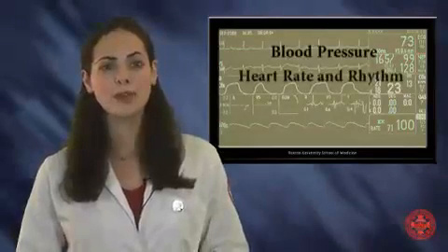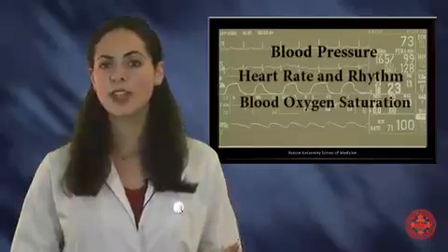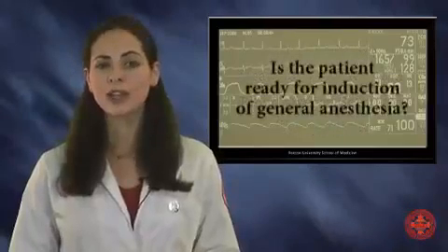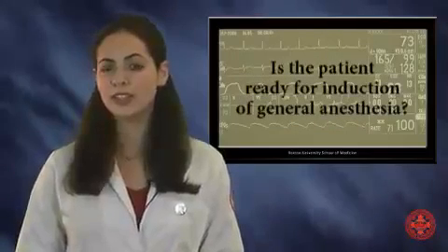Now that the monitoring devices have been connected, the anesthesiologist can monitor the patient's blood pressure, heart rate and rhythm, blood oxygen saturation, and temperature throughout the anesthetic. Is the patient now ready for induction of general anesthesia?